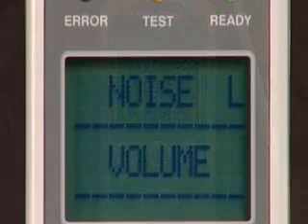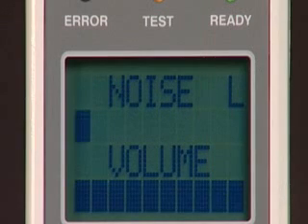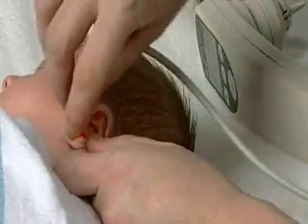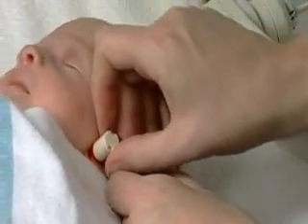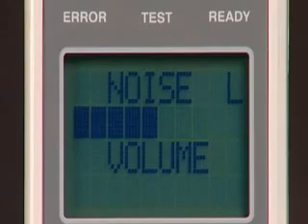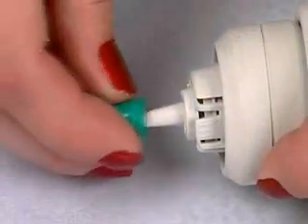If either bar does not move to the left of the screen, then a problem exists. If the volume bar will not move to the left, a proper seal has not been obtained — try repositioning the probe or selecting a different ear tip. If no volume bar is shown, the probe may be resting against the ear canal or debris such as cerumen or vernix is present. To fix this, try repositioning the probe, replacing the ear tip, or checking for debris in the probe.